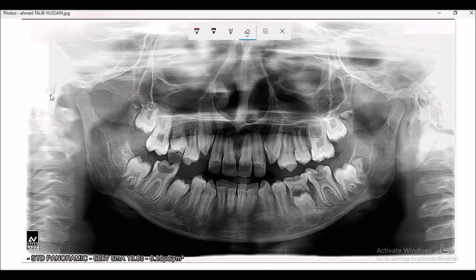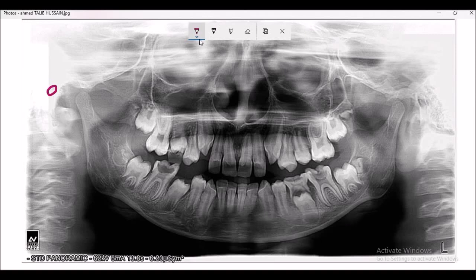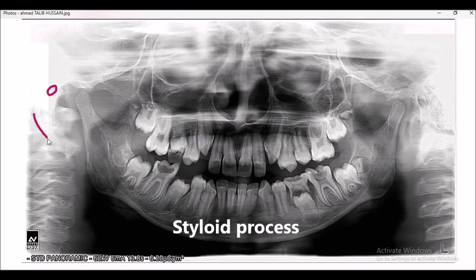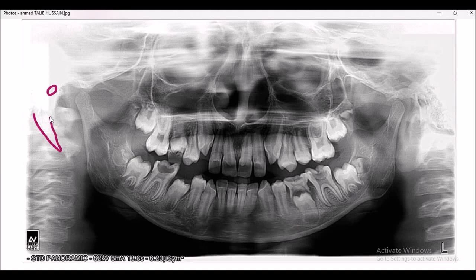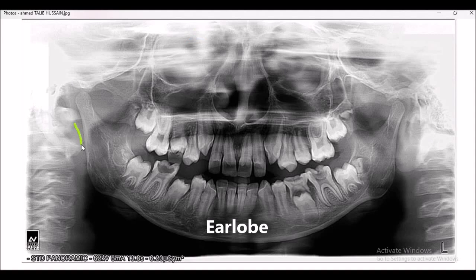Let's begin with the landmarks. This rounded opening is the external auditory meatus — you can see it on the opposite side as well. The second landmark is known as the styloid process. You can also see these two shadows which are the earlobes; this is the earlobe of the right side.